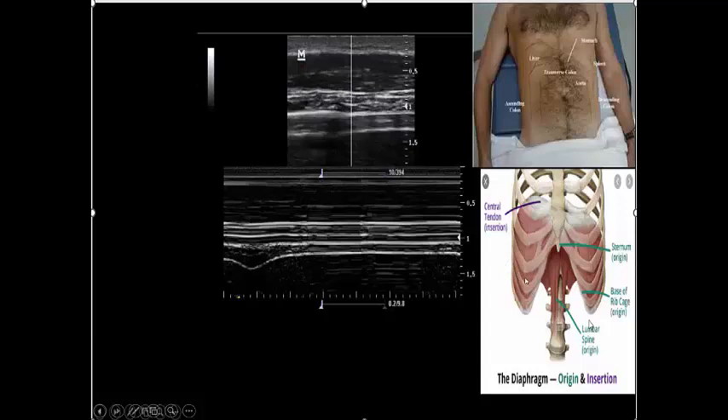Because the costal part of the diaphragm is very superficial to the skin, I will use a high-frequency probe. I will put the high-frequency probe here in the intercostal space, trying to be as vertical as possible. What I will see is: first the skin, then hyperechoic subcutaneous tissue, then the intercostal muscles, and after that I will reach the diaphragm.